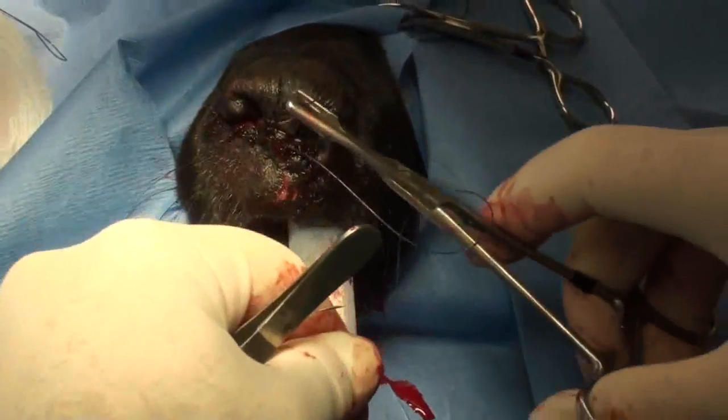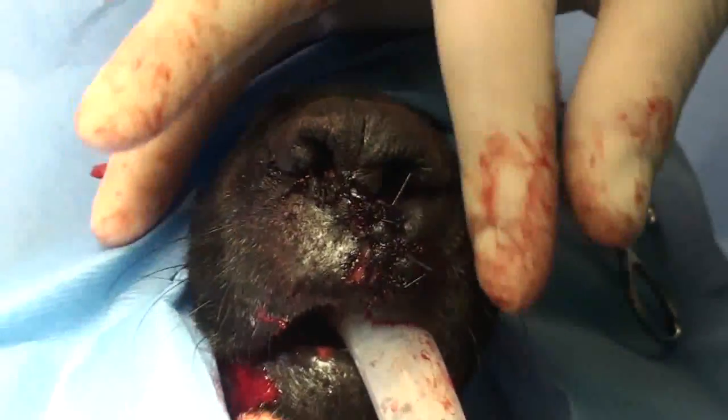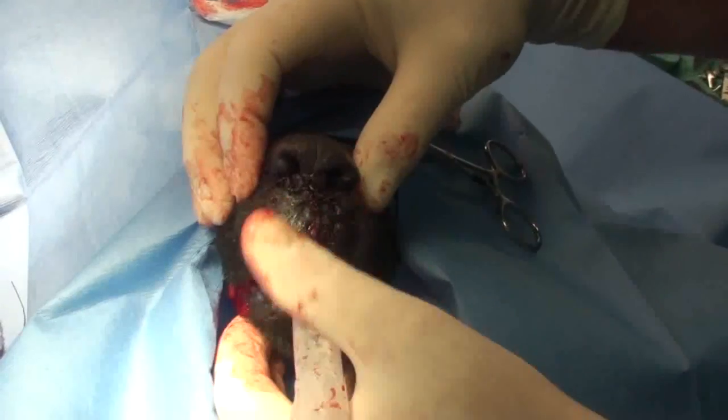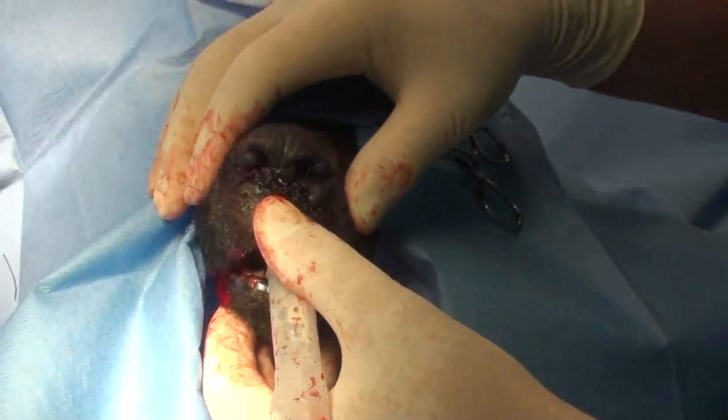So now we're going to close this up. You can't hardly see the wound, and as long as this dog leaves this alone, it should heal up just perfect. And there you have Dr. Martinez's nose job.